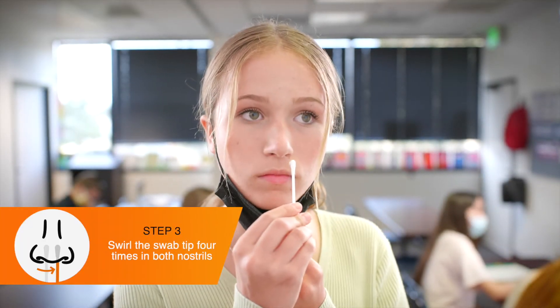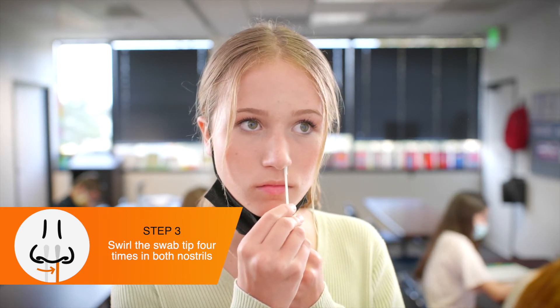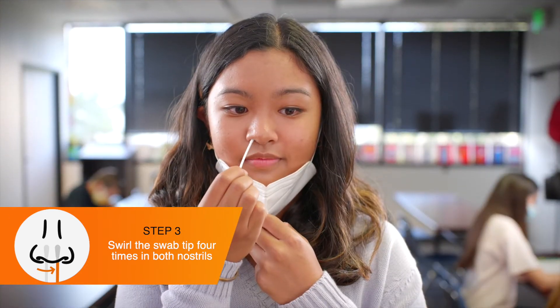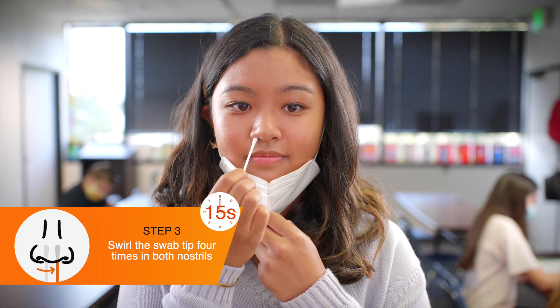When ready, participants should lower their face mask below their nose and insert the cotton tip of the swab no more than three quarters of an inch into the nostril. Participants swirl the tip around the inside of each nostril at least four times for about 15 seconds.